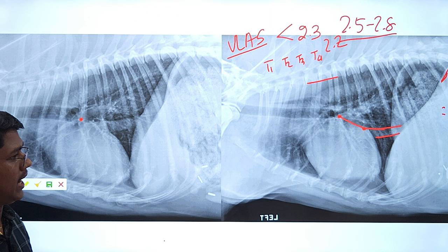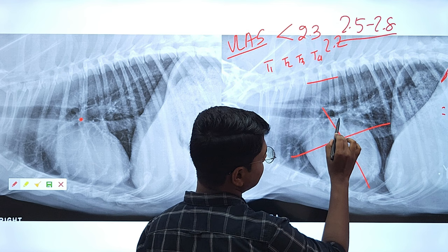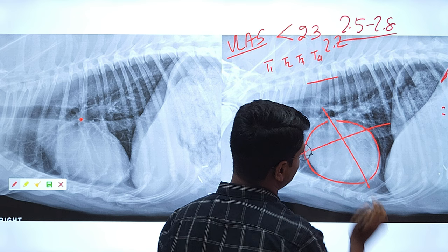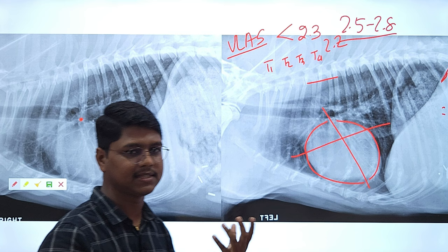You should also remember the cardiac chambers visible in the lateral view. The left atrium is visible dorsally, then the left ventricle, and the right auricle. If you find enlargement of a particular region, you can guess which chamber is enlarged.